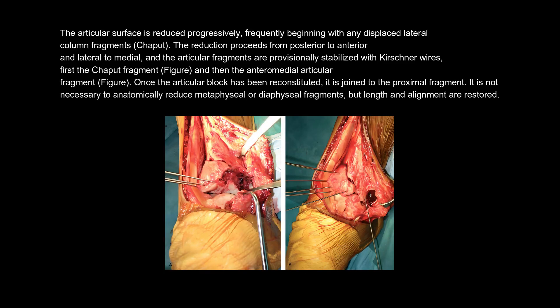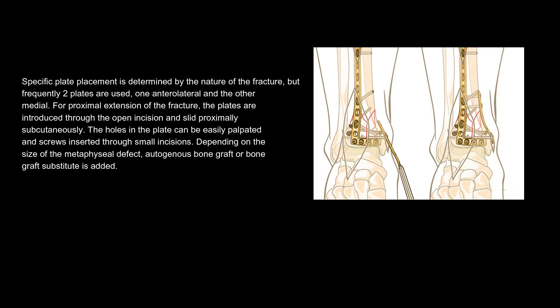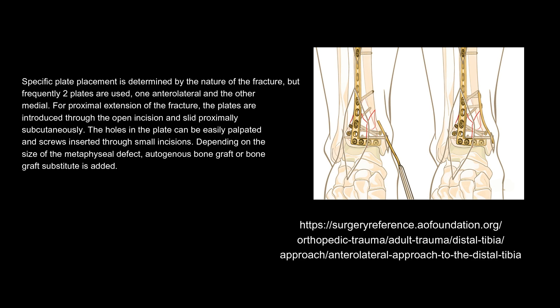The articular surface is reduced progressively, frequently beginning with any displaced lateral column fragments, Chaput. The reduction proceeds from posterior to anterior and lateral to medial, and the articular fragments are provisionally stabilized with Kirschner wires — first the Chaput fragment, and then the anteromedial articular fragment. Once the articular block has been reconstituted, it is joined to the proximal fragment. It is not necessary to anatomically reduce metaphyseal or diaphyseal fragments, but length and alignment are restored. Specific plate placement is determined by the nature of the fracture, but frequently two plates are used: one anterolateral and the other medial. For proximal extension of the fracture, the plates are introduced through the open incision and slid proximally subcutaneously.